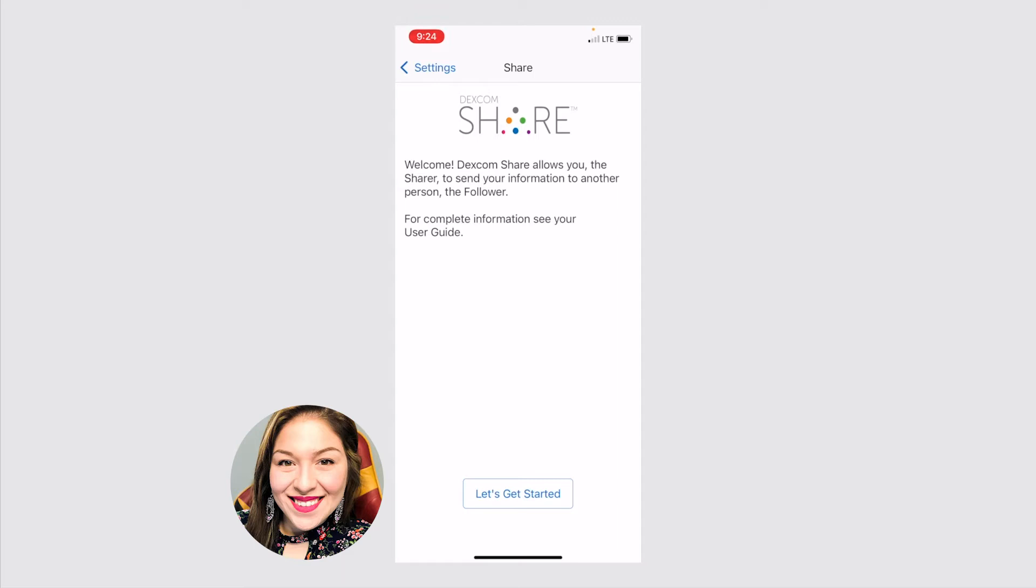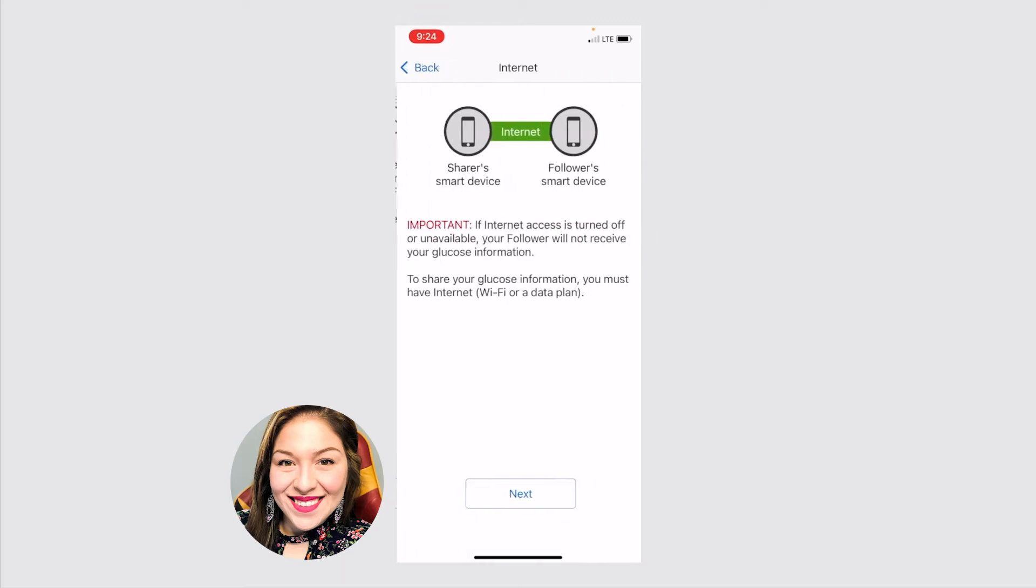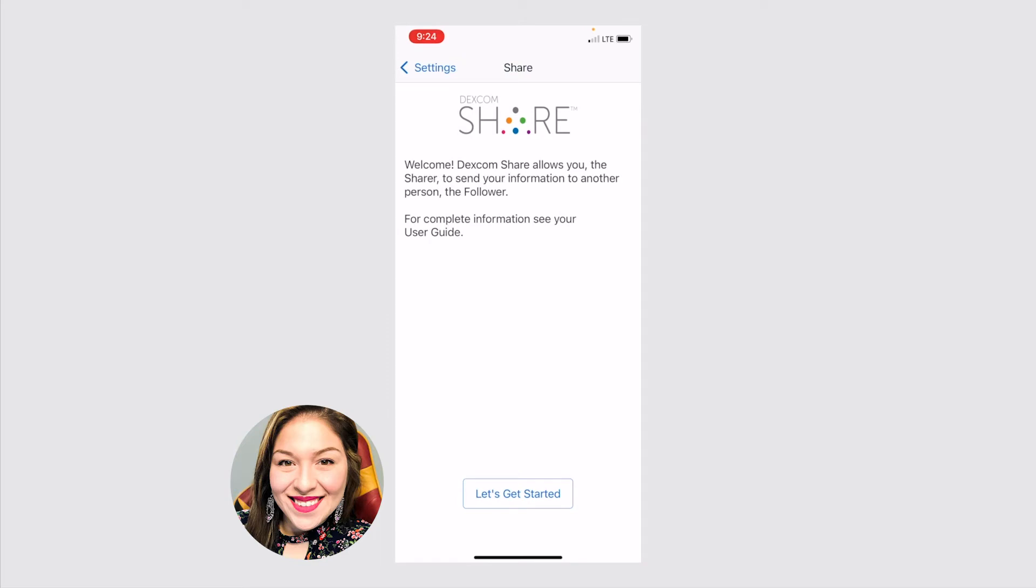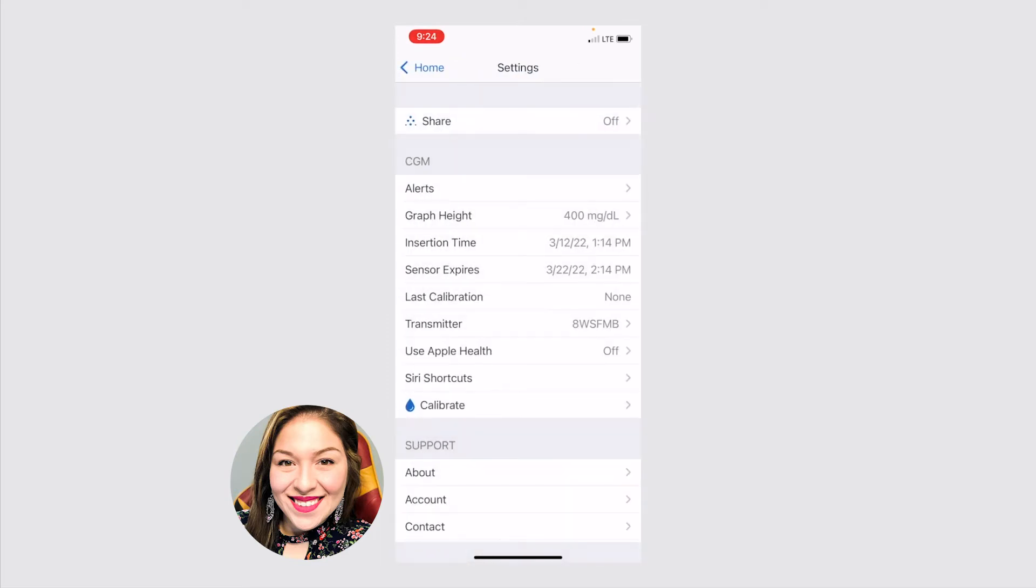It's super easy. You just click let's get started. And it takes you step by step through the process on setting up the other person's phone. So you just follow through. And then it'll show up here that your share setting is on.